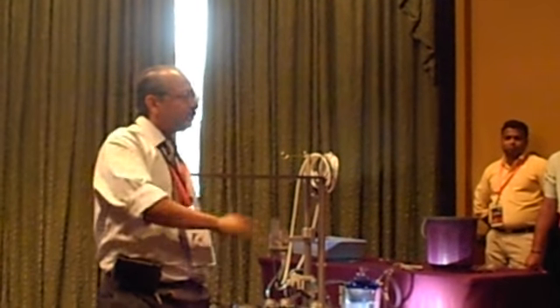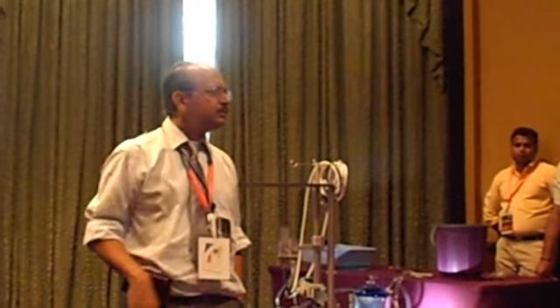sweep gas has got nothing to do with whether there is flow. The oxygenator is having adequate flow, done. Then, what time is it again?